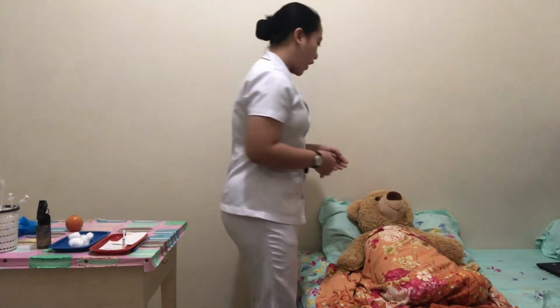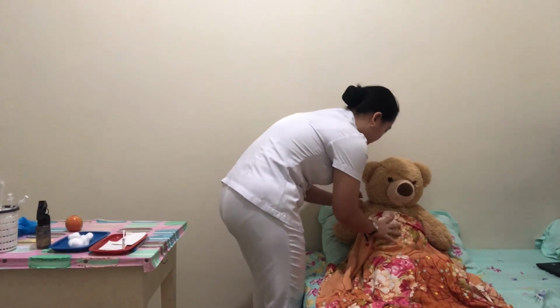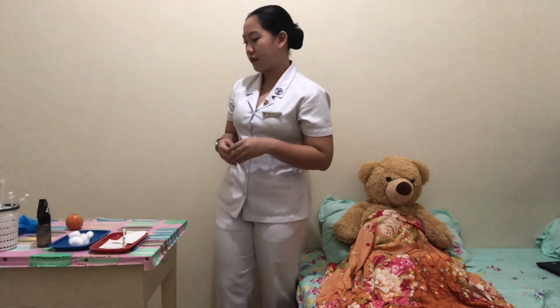And then assist the client to a comfortable position that will accommodate the injection site chosen and expose only the portion of the body. So I will position my patient in a sitting position. So now apply gloves and use anatomic landmark to find the site again.